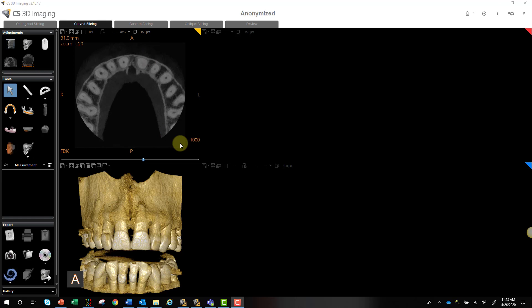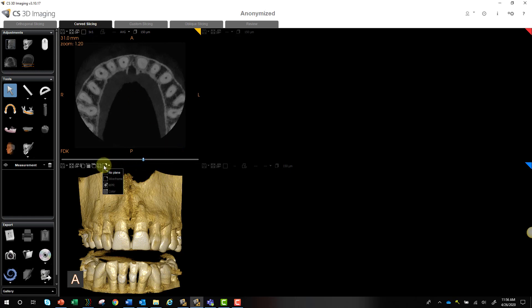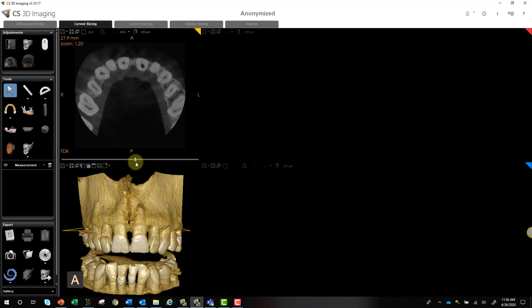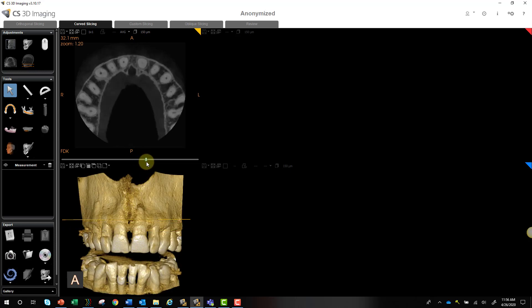Now remember to go through the entire scan edge-to-edge and diagnose everything before you focus on the area of interest. We're not going to do that here for the sake of this video, but just a reminder. So we'll start off in our Curve Slicing tab. We can turn on our planes just to see where we are, and we can begin creating our panoramic curve.